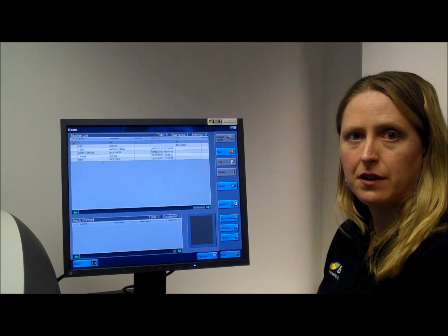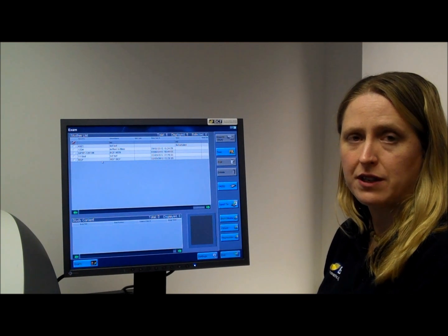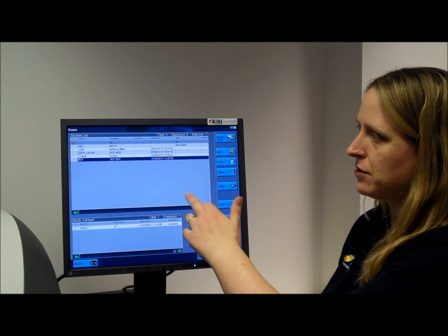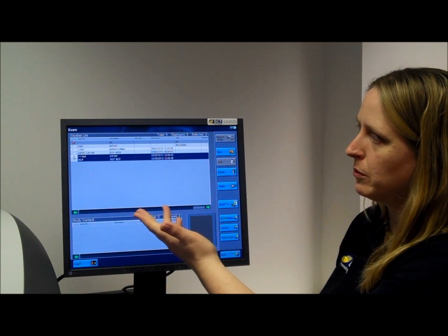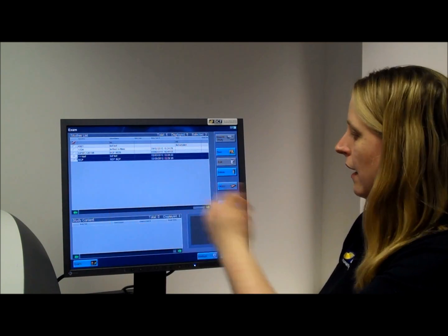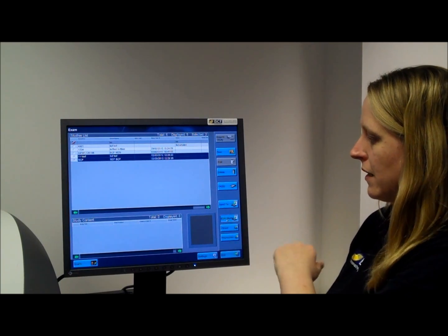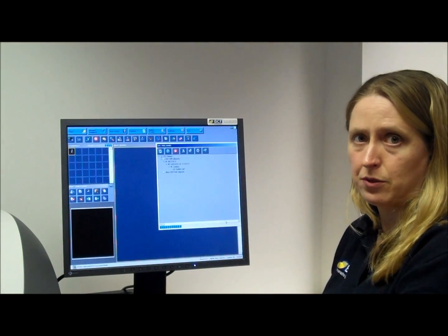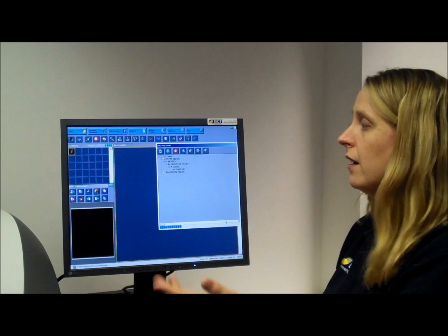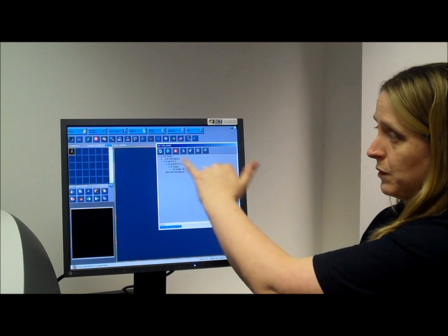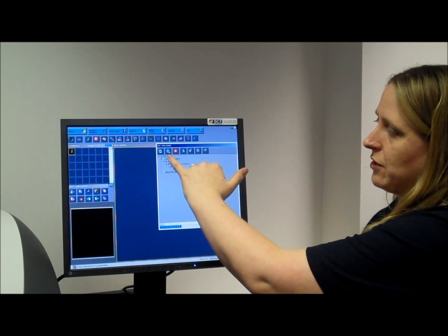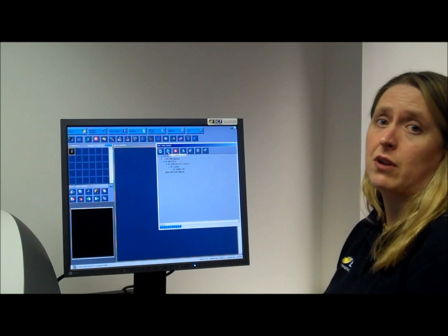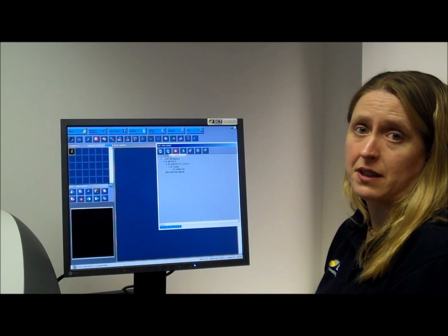If you want to burn your patient straight to CD, all you need to do is highlight the patients that you want — you can highlight multiple patients — and then just click burn media. The system will automatically load all their pictures straight into the box, and then just click on the green tick and they'll be burnt to disk.